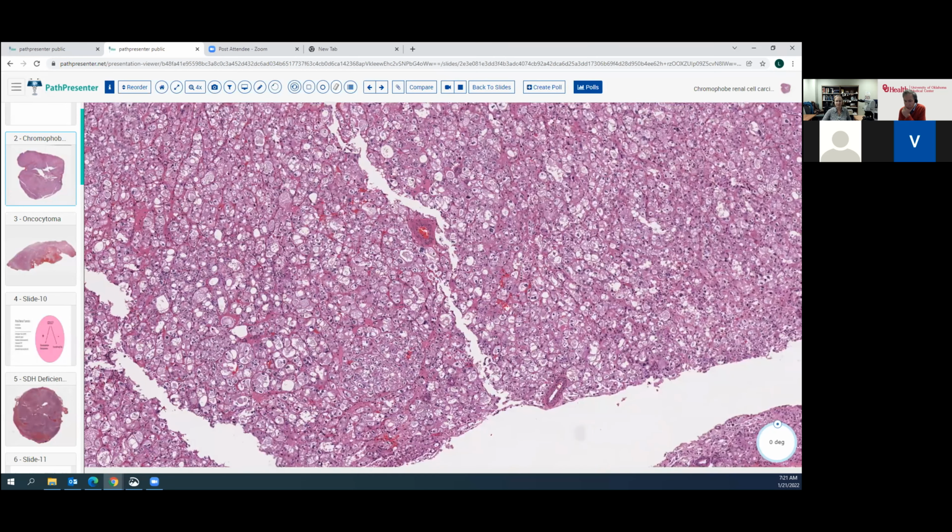Are there any additional questions? So Laura, is it known what's in those eosinophilic globules? Are those a particular protein product from one of those defects in the pathways? Yeah, it's just condensed, I think, tuberin. Tuberin, and I can't quite remember, I want to say it's fibrillin or something, but it's condensed mutated, deficient proteins. Great.